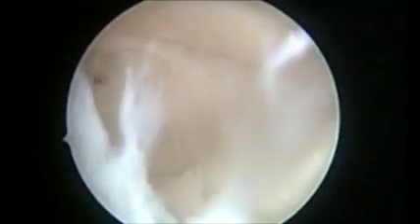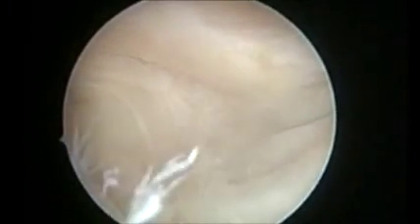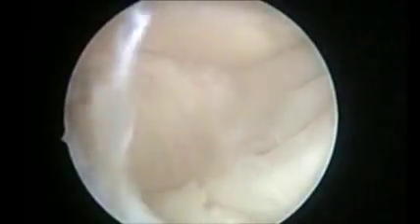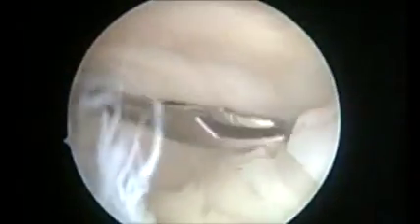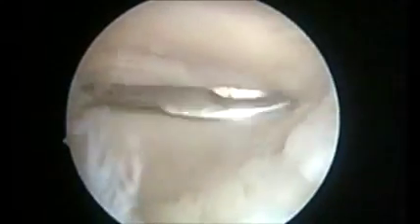The next step in the management of Baker cyst is to enlarge the one-way opening of the capsule and to make it a big opening so that there is a bidirectional flow of synovial fluid. Another hypothesis that is put forth is that the healing of the big opening in due course will take care of the recurrence. A basket punch and a motorized shaver can be used alternately to enlarge the opening.